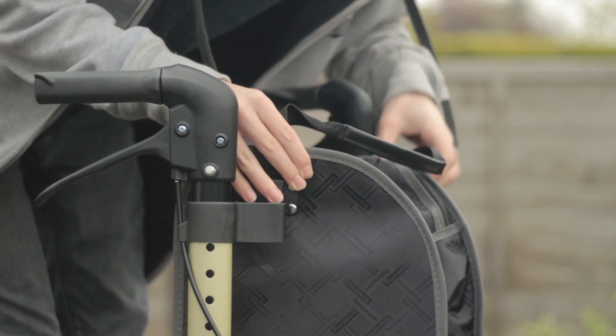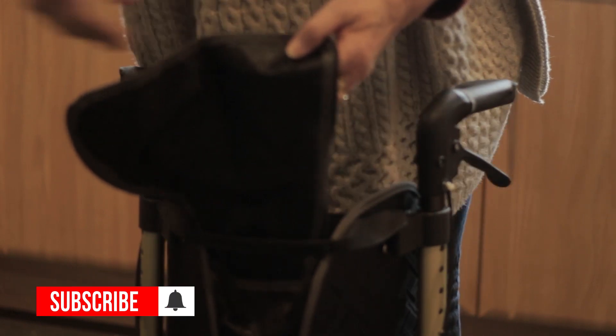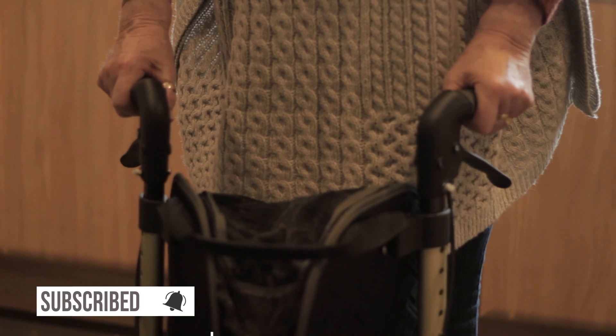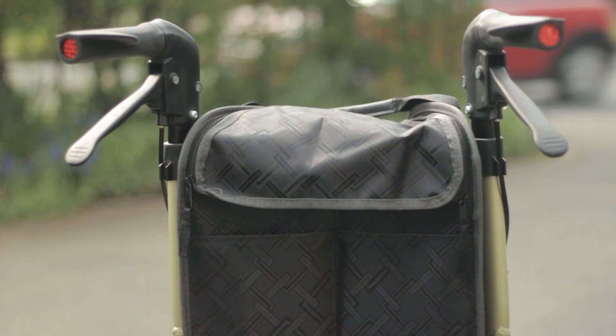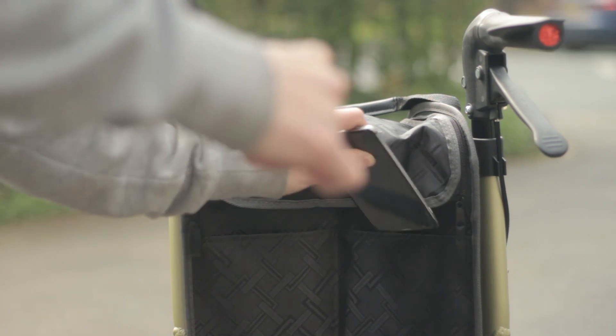This makes it ideal for carrying everyday items such as shopping. On the back of the bag there are two small pockets ideal for carrying small things.